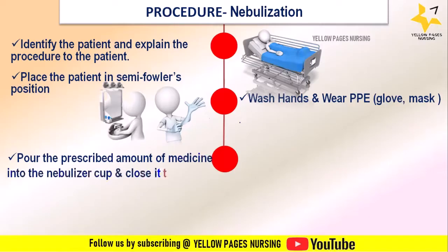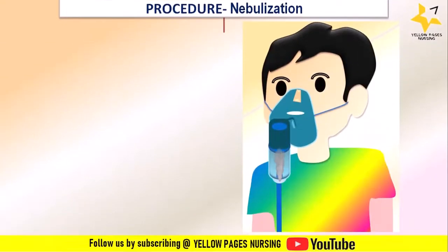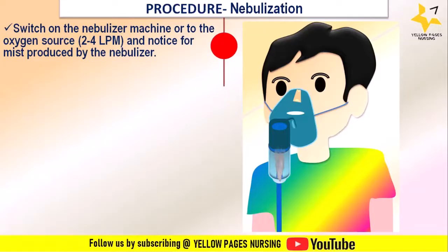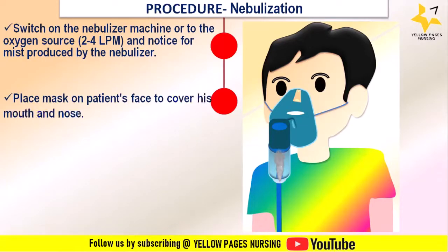Pour the prescribed amount of medicine into the nebulizer cup and close it tightly. Connect the nebulizer kit tubing to the nebulizer machine or oxygen source. Switch on the nebulizer machine or oxygen source at 2 to 4 liters per minute and notice the mist produced by the nebulizer. If there is no mist, recheck the mask and nebulizer for malfunction.